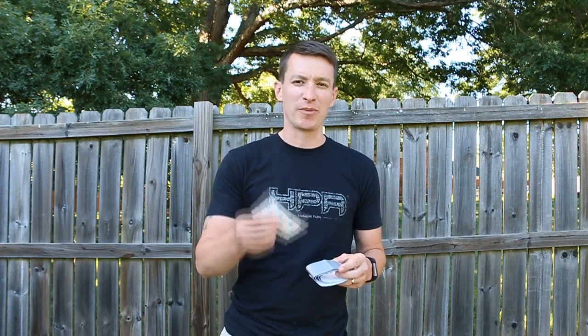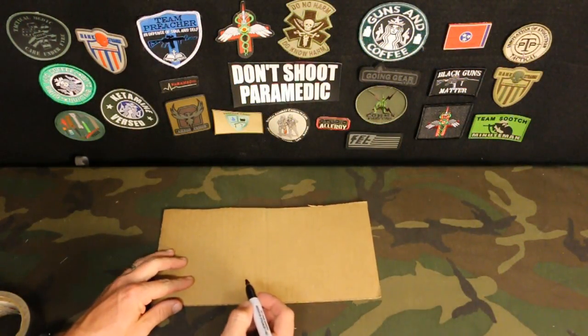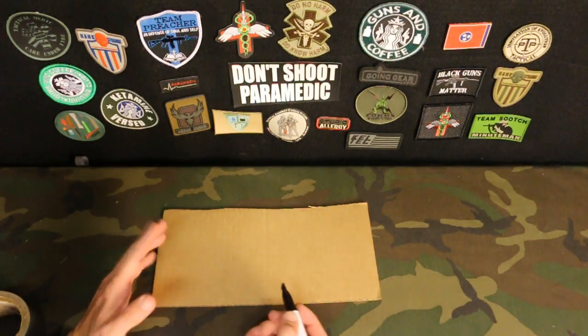In this video I want to show you how to make your own butterfly bandages out of duct tape. And everybody has duct tape, right? Alright, so first let's talk about why we are going to use butterflies.